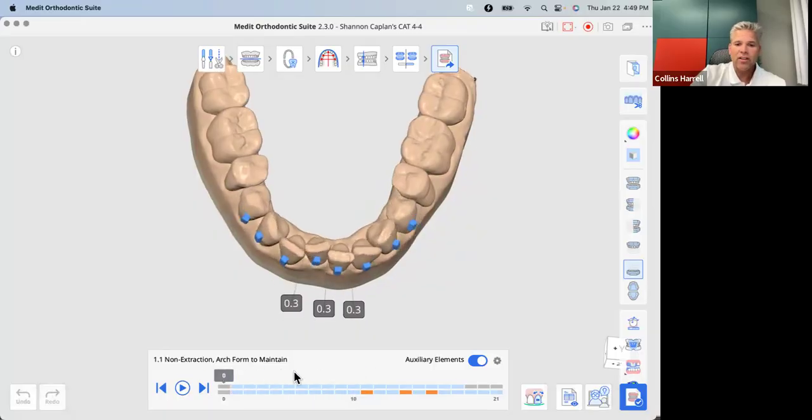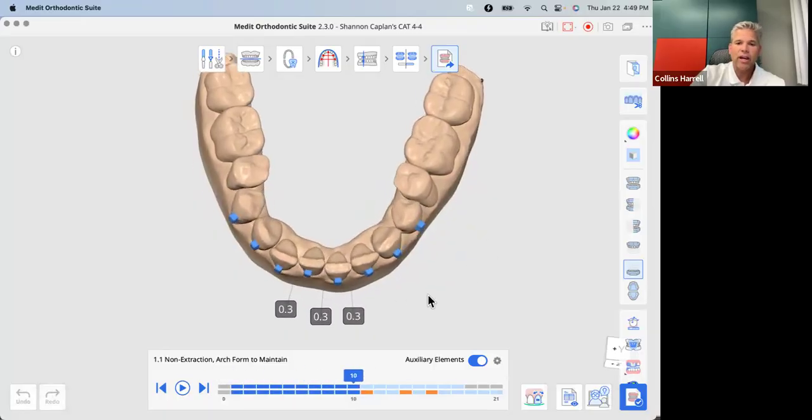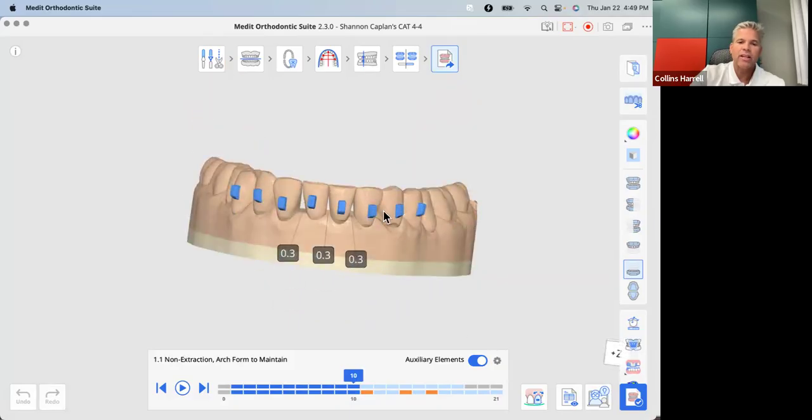We're going one set of aligners to get to a point where I can go in and refine some things a little bit, do some IPR, do it all at one time, take a new scan, and then we'll go in and re-simulate the case and basically take our next stroke. And then assume that you're going to probably need a little bit of putting at the end of the case where you just do a few more aligners to get everything just perfect.